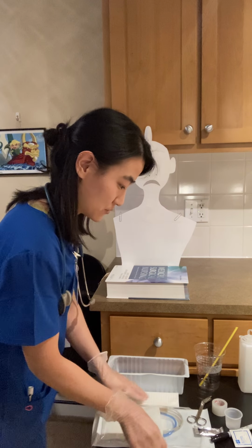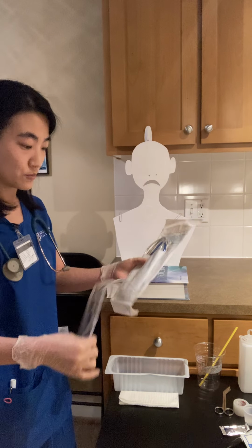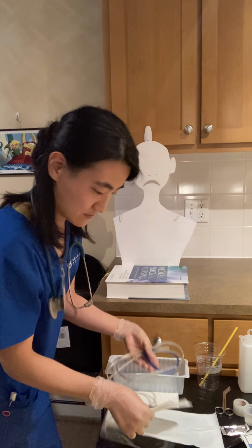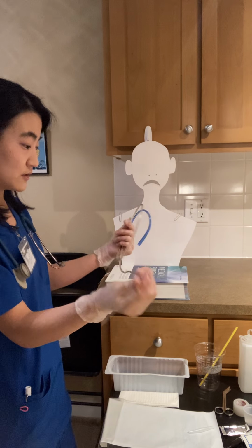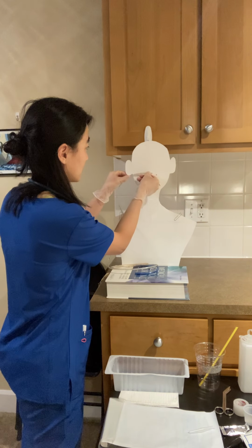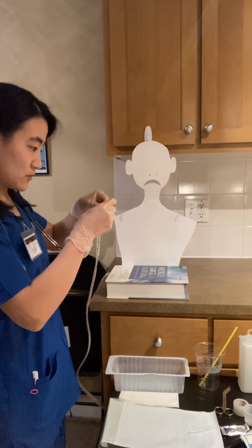And then I'm going to, so in real life, this would be a still unopened package that I am just opening now for the procedure. And I'm going to measure the nasogastric tube by measuring from the tip of his nose to his earlobe, and then his earlobe to his xiphoid process. And I'm going to just mark that with a bit of tape.